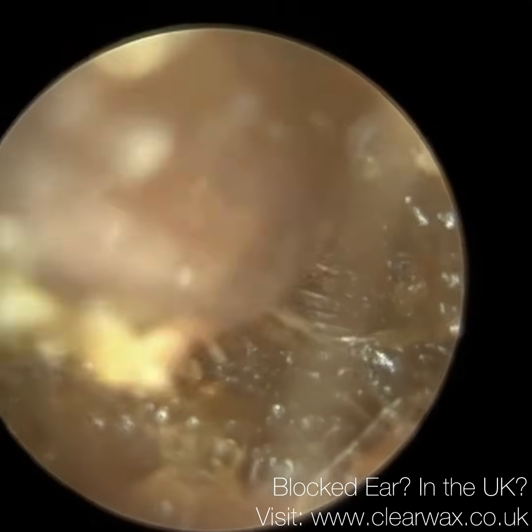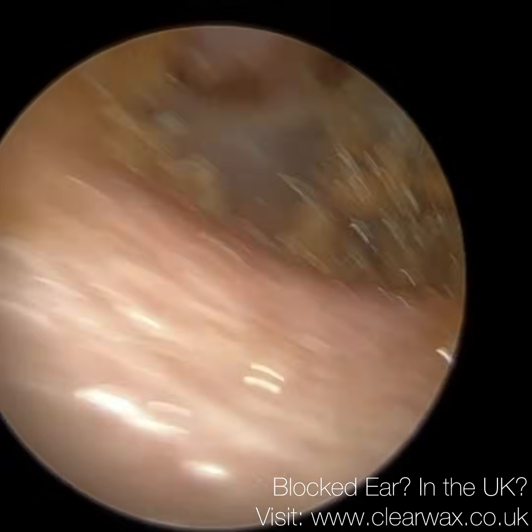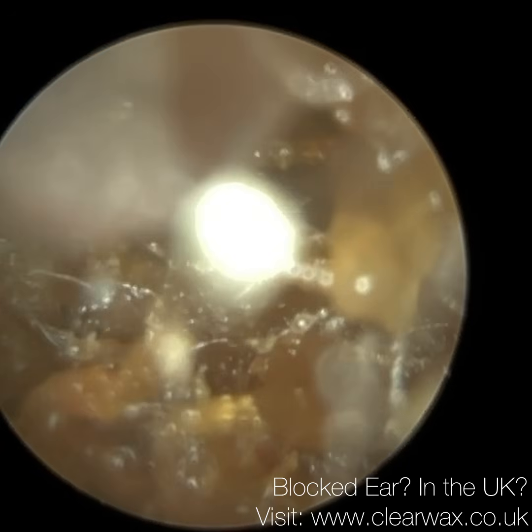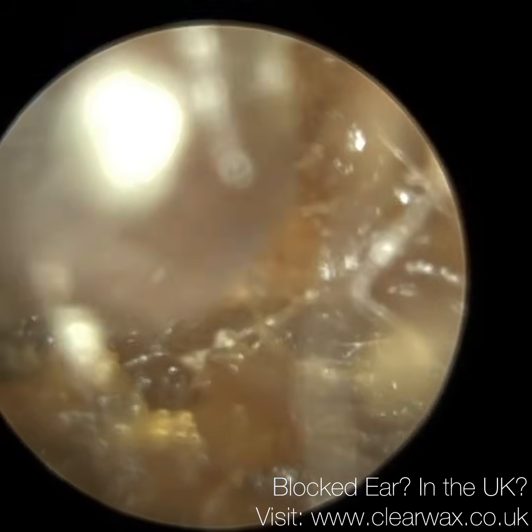And it also differs from a keratosis obturans. So keratosis obturans is when you have a plug of epidermal skin, so the outer layer of skin that sheds from the ear canal, it abnormally sheds, forms into a plug, almost like a rubber ball, and then it completely occludes the ear canal, and it compresses against the walls of the ear canal.